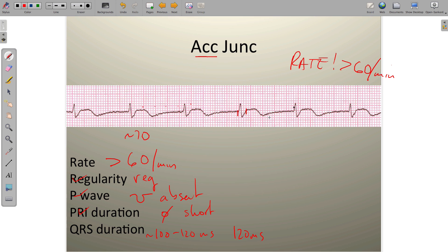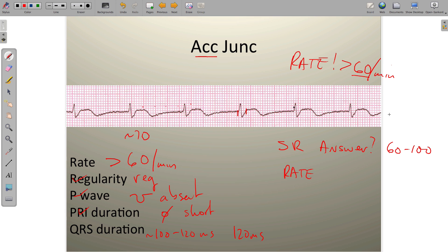The question you should ask yourself is: how do I differentiate accelerated junctional rhythm from sinus rhythm? Not by rate, since both can be 60 to 100 BPM. The key difference is the absence or inversion of P waves in junctional rhythm. In sinus rhythm, the P wave is upright and precedes the QRS with a normal PR interval; in junctional rhythm, P waves are absent or inverted and the PR is either absent or short.